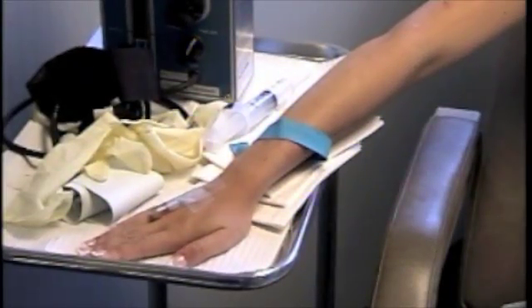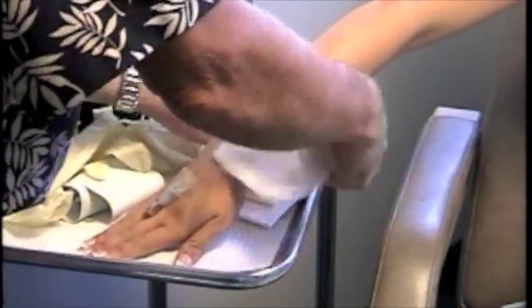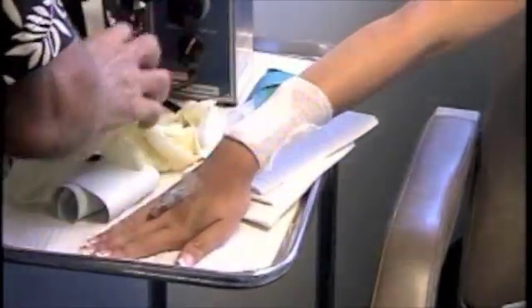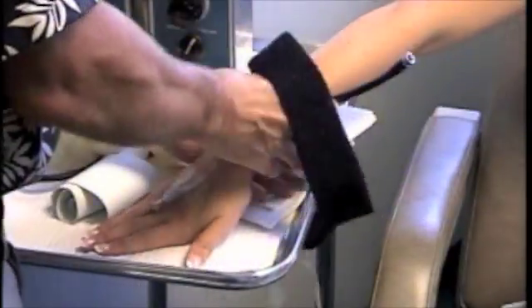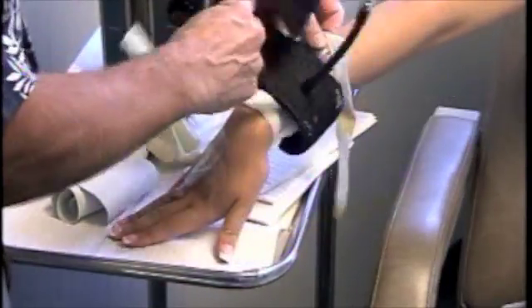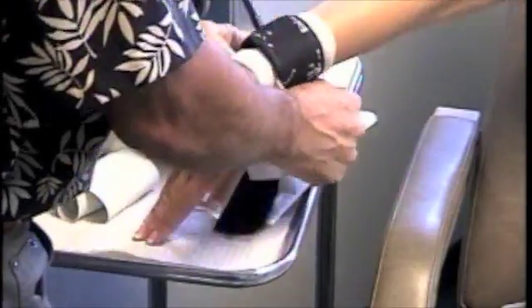My name is Dr. Perry Solomon, and what I'll be describing today is the modified Bier block, a technique I developed from an old anesthetic technique that's been around for over 100 years. On this patient is a 17-year-old girl who I've been treating for several years for excessive sweating of her hand. I'll be starting an IV intravenous in the back of her hand and putting a tourniquet around her wrist to prevent blood from entering her hand after I've squeezed it out using an Esmarch, a flat bandage you'll be seeing in a moment.